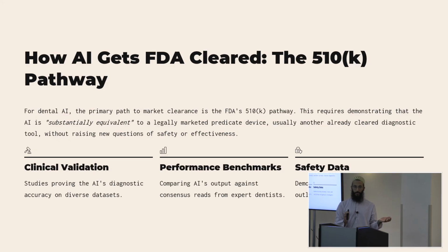In the initial data set, there was no training on the scans. What we saw was that it did pretty good. I don't have numbers to quantify that, but it worked. It just can't be guaranteed in the same way. For example, let's say you went to another clinic and they sent you the radiograph. Yeah, that should be fine. At least we tried to maximize the image quality types, to have as diverse a data set as we can.